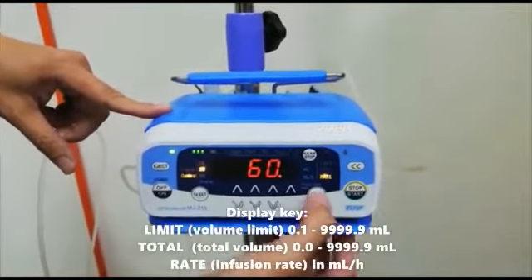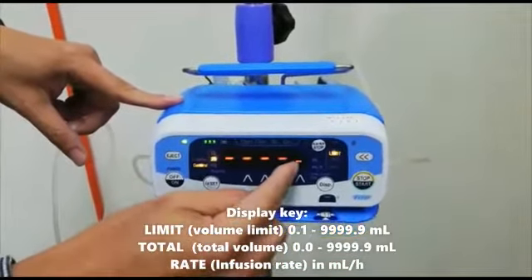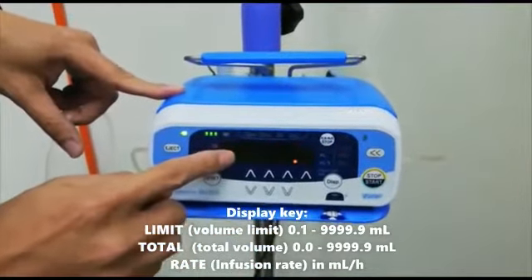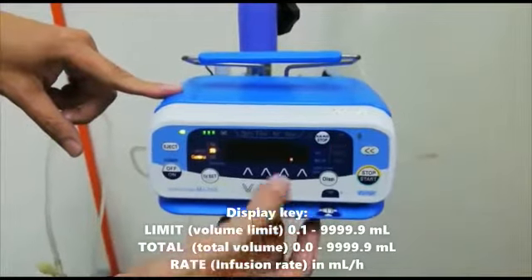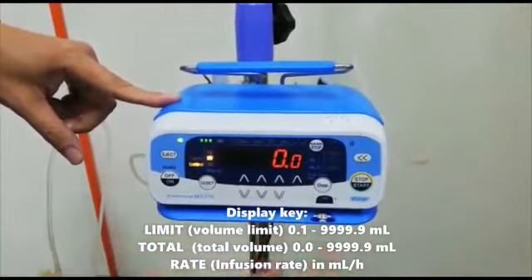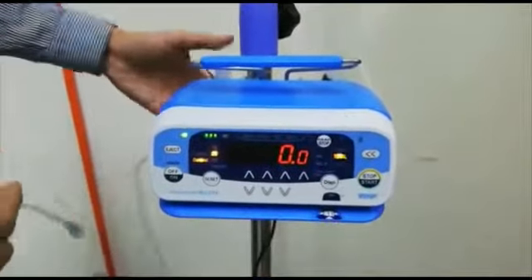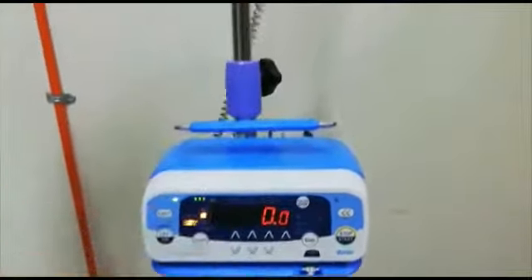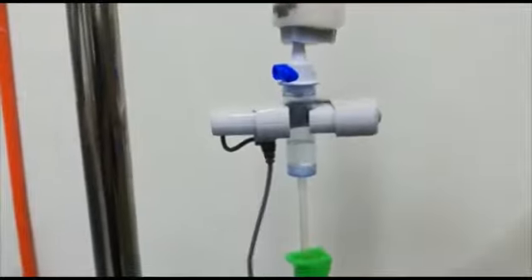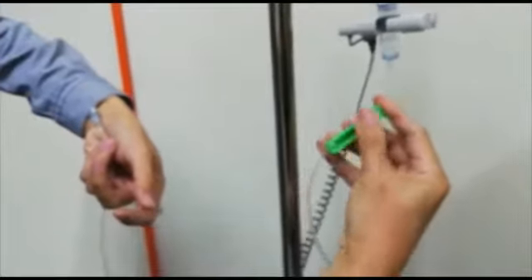Next you press the display here, and it will go to limit. We have a limit function. It can go from 0.1 up to 9999.9. Like this one, there's no preset limit. For example, you can set 1 mil. Then this total volume is to check the total infusion, but I haven't started, that's why it shows zero. After that, this end goes to the patient. Before you start, you have to apply the drop sensor. Like this. Make sure it's above the solution and below the nozzle. Then this goes to the patient, and you release this clamp. Then you can press start.